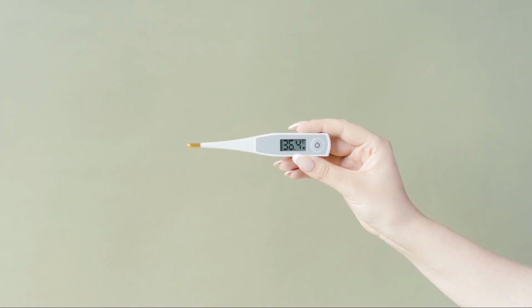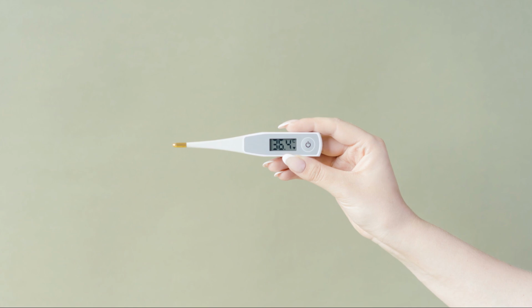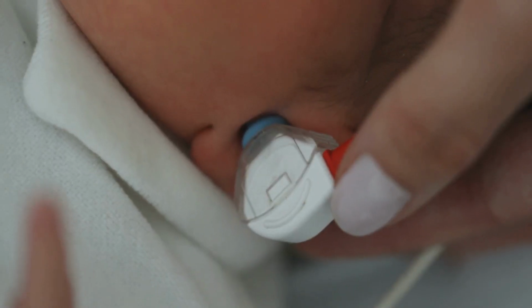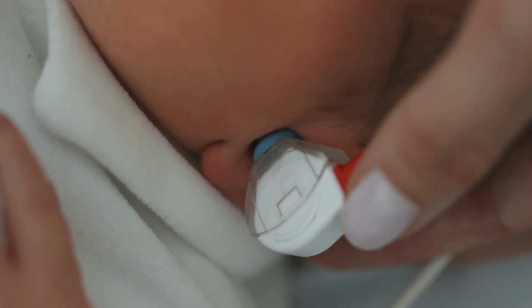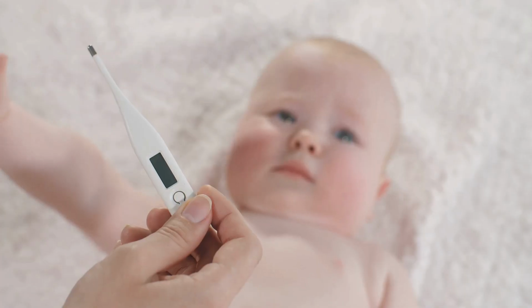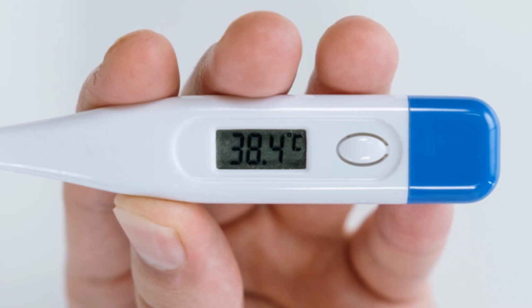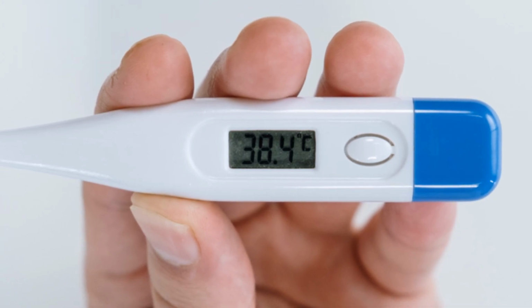When using a digital thermometer, ensure it's clean and properly calibrated. For oral readings, place the thermometer under the tongue. For tympanic readings, gently insert the probe into the ear canal. For forehead readings, sweep the thermometer across the forehead. Always follow the manufacturer's instructions for accurate results.